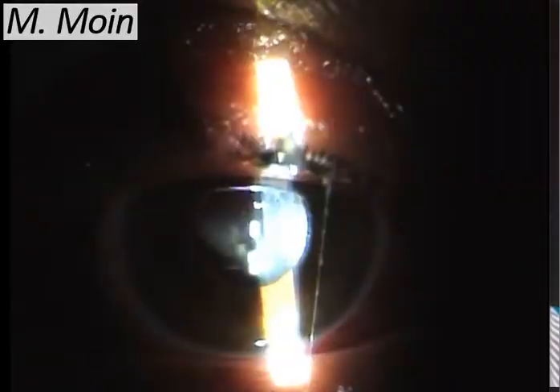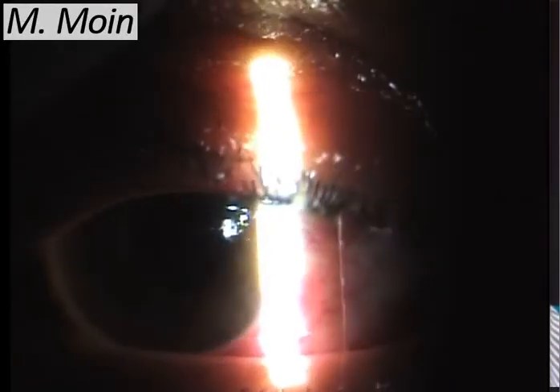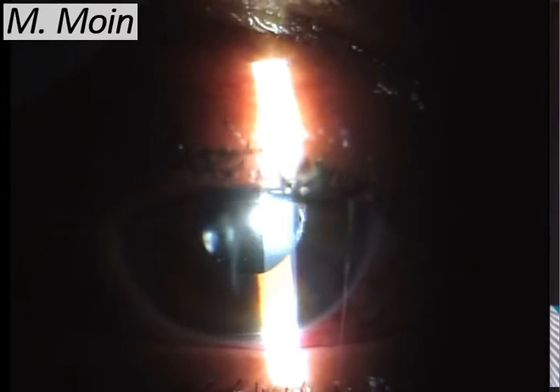Hi, welcome to this video on slit lamp examination. Today we're going to show you a very interesting case, which is actually gas in the vitreous cavity post retinal surgery.